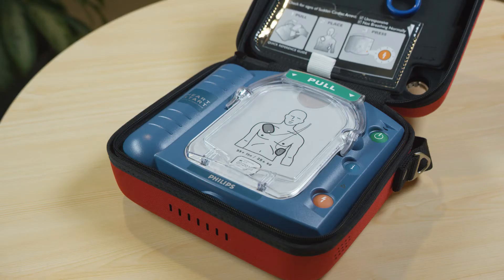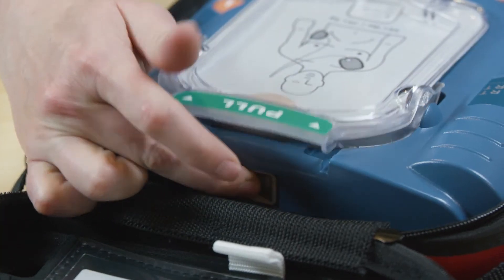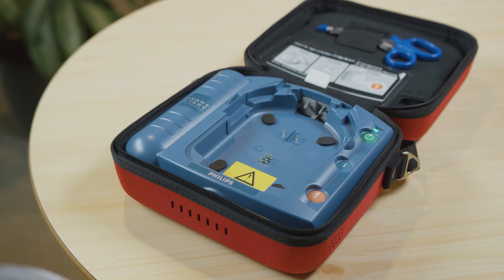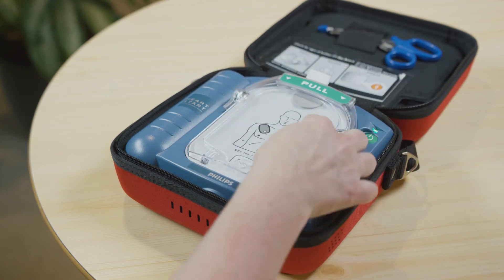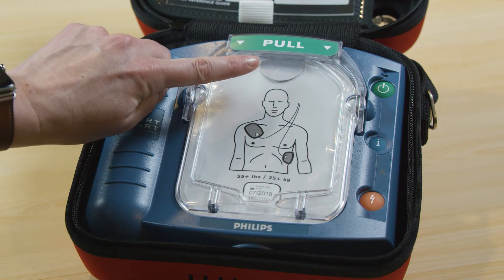Replace your pads when they reach their expiration date. To replace the pads cartridge, slide this lever to pop out the old pads and drop in the new pads, placing the bottom end of the cartridge into the compartment first and pushing down until it clicks. Make sure you don't open the film seal of the cartridge until you need to use the pad.